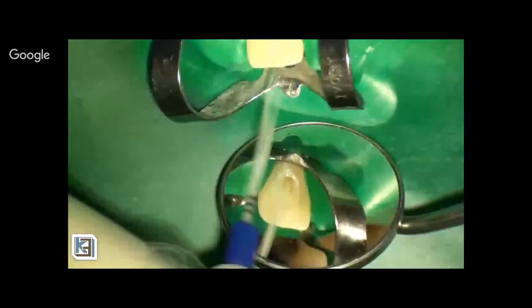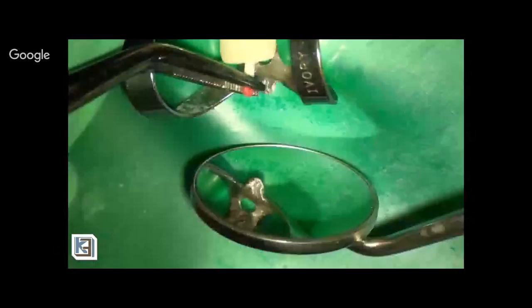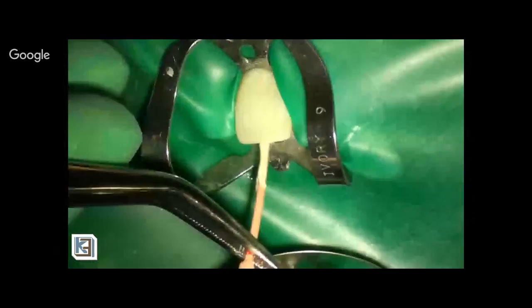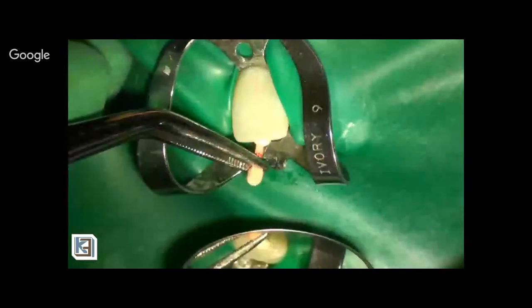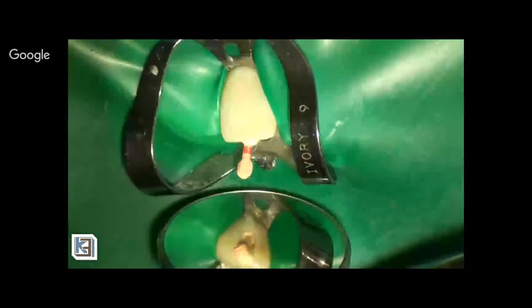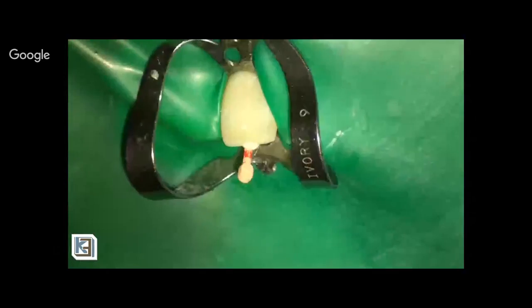This is called the agitator, a vibrating instrument that we use to agitate sodium hypochlorite and EDTA inside the tooth to increase cleaning and disinfection. Paper points, dry it up, and then placing my master cone with the sealer. Pump the sealer a little bit in there. Make sure you get it all the way down to the apex. And you finish your root canal regularly.